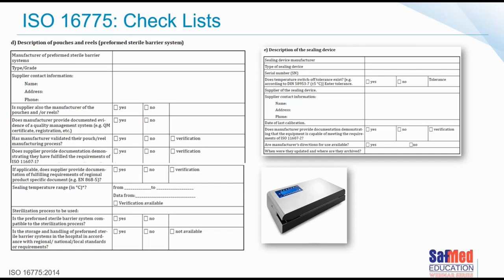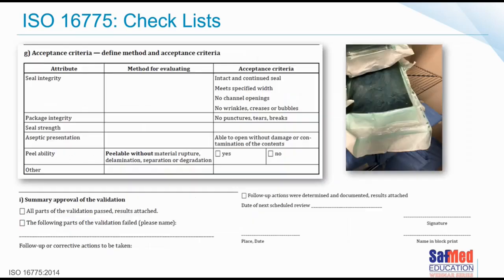Has the supplier given you the sealing temperature? What is that sealing temperature? Quite in depth. When last was your heat sealer serviced or calibrated? In depth process, as you can see. So that's why I think it's time that we write a really nice guidance document. Nobody's done this to the best of my knowledge yet in the country, and it's something we really and truly should be doing.